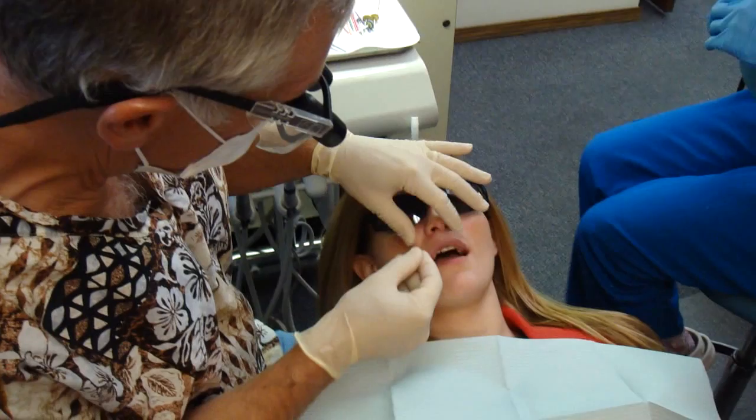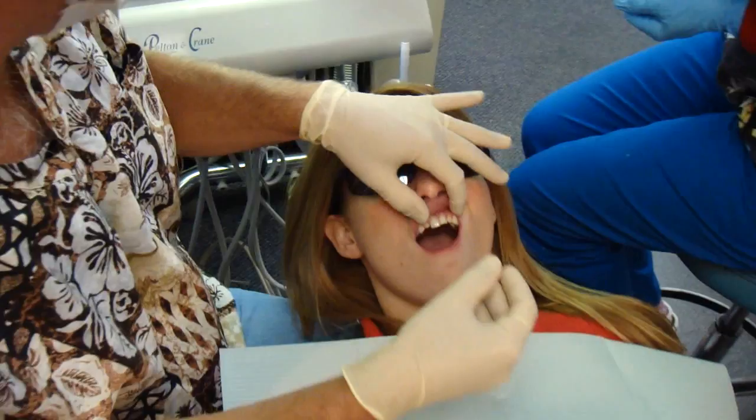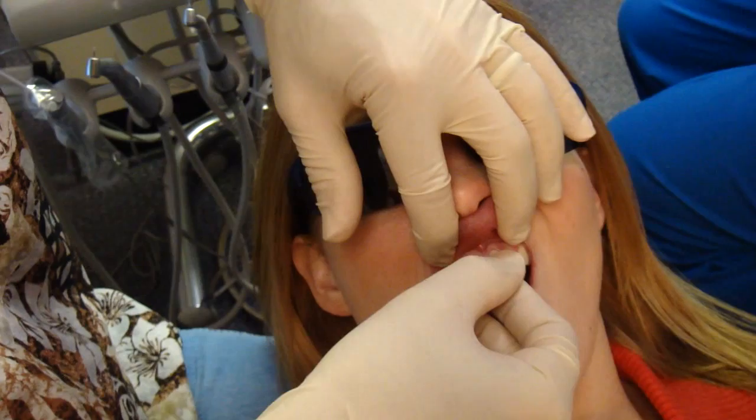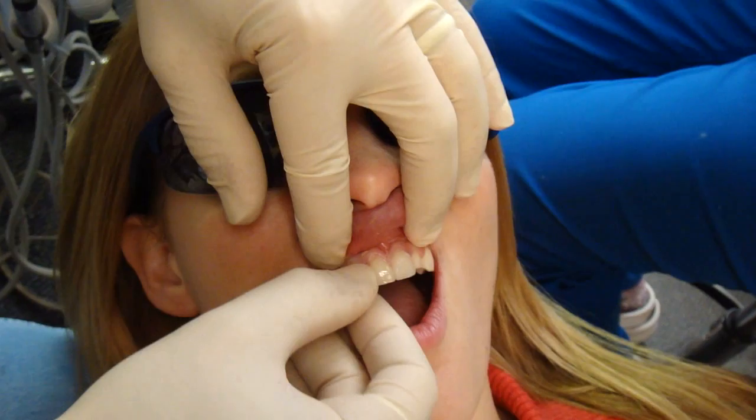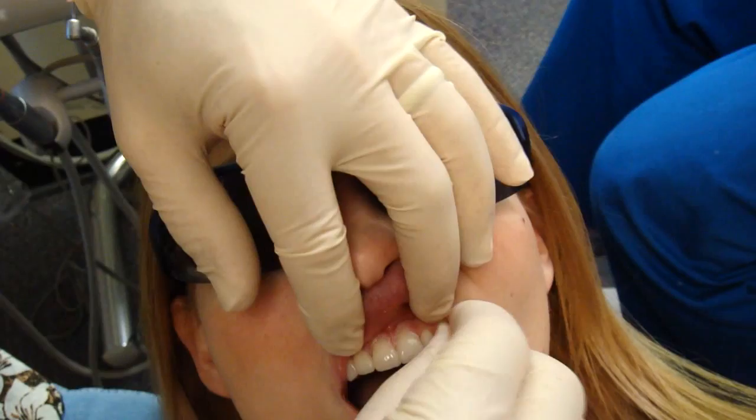Here's a close-up shot of Kim's veneers. Okay, so we're going to try in your veneers — we've taken the temporary ones off. There's a central, there's another central, there's another central. Let's try your lateral on. These fit perfect.